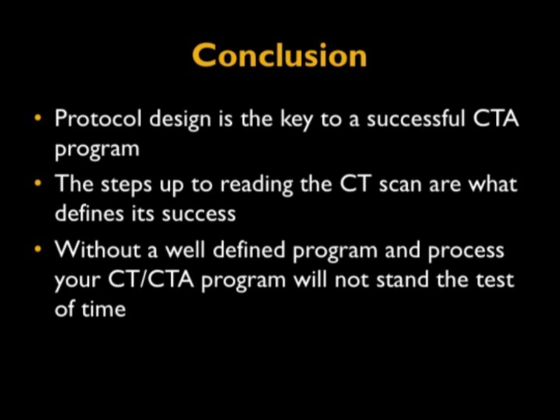And I think if you don't have a good structure in place, it's going to be very hard to have a really strong CTA program. We're doing 50, 60 CTAs a day. We have a very well-defined program. We're very busy, but it's a combination of working with the technologists and nursing and radiologists to make all this happen. And it's really hard to make a good program without getting buy-in from everybody. So I think you all know that, and our techs know that. So very important to have everybody working on the same page.